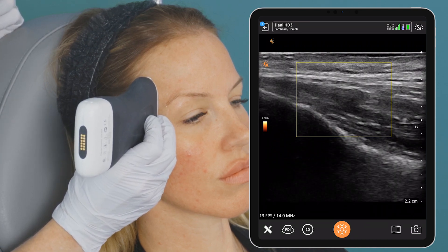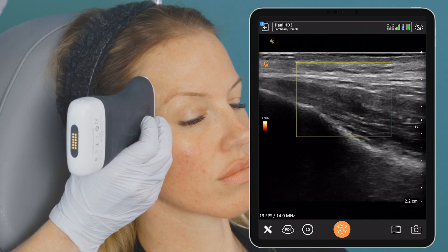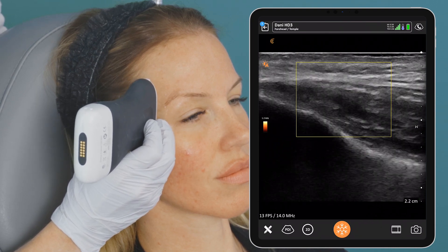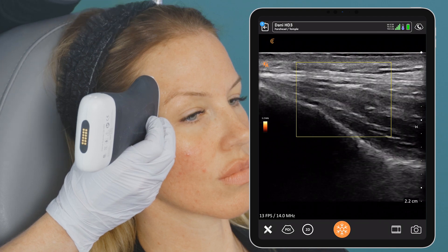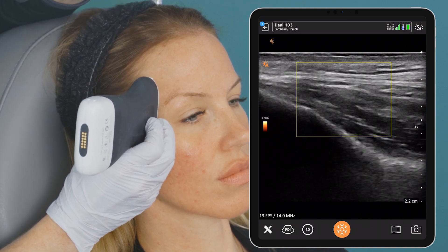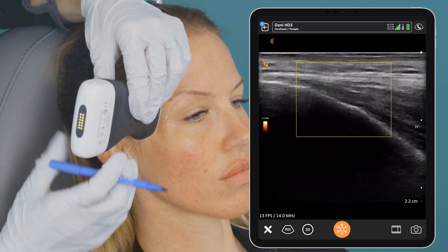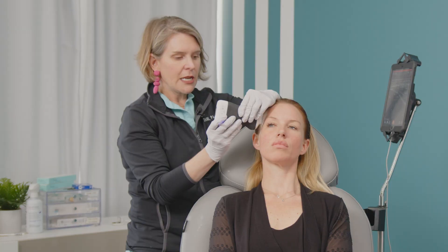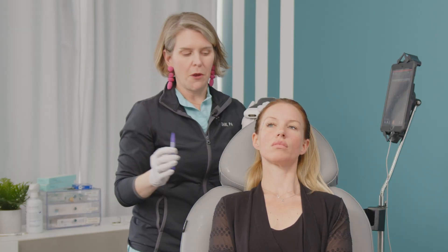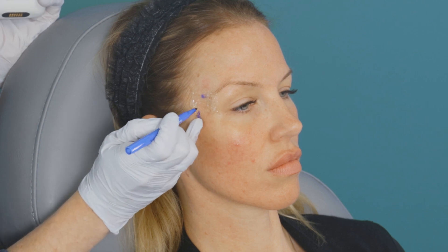This is also where I plan out my attack for the temple. I use the analogy of a guy with a machete chopping down the jungle to create a path. We've created a very narrow path of a view as to where we're going to get an in-plane injection with our cannula. To recreate this path, we need to mark the bottom of the probe — that's the beginning of our jungle path. I've created a point A to point B scenario: point A is the bottom of my probe, and point B is the middle marker where I just visualized. I want to go from point A to point B and lay my bolus right in the middle of that pool.